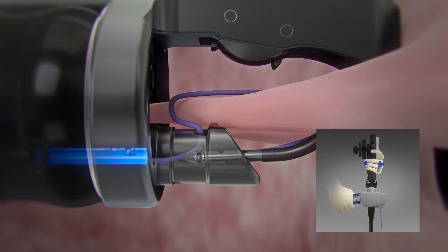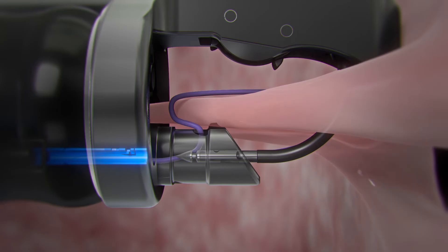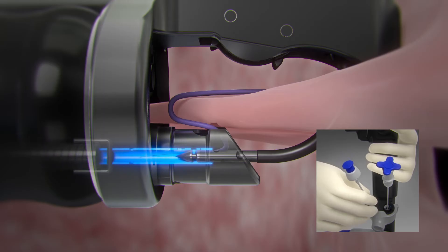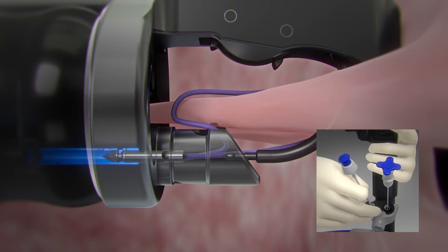Close the needle driver handle to pass the anchor and suture through tissue. Advance the anchor exchange catheter over the anchor until the locking mechanism engages. Without pressing the blue button, pull the anchor exchange catheter back to disengage the anchor from the needle body.